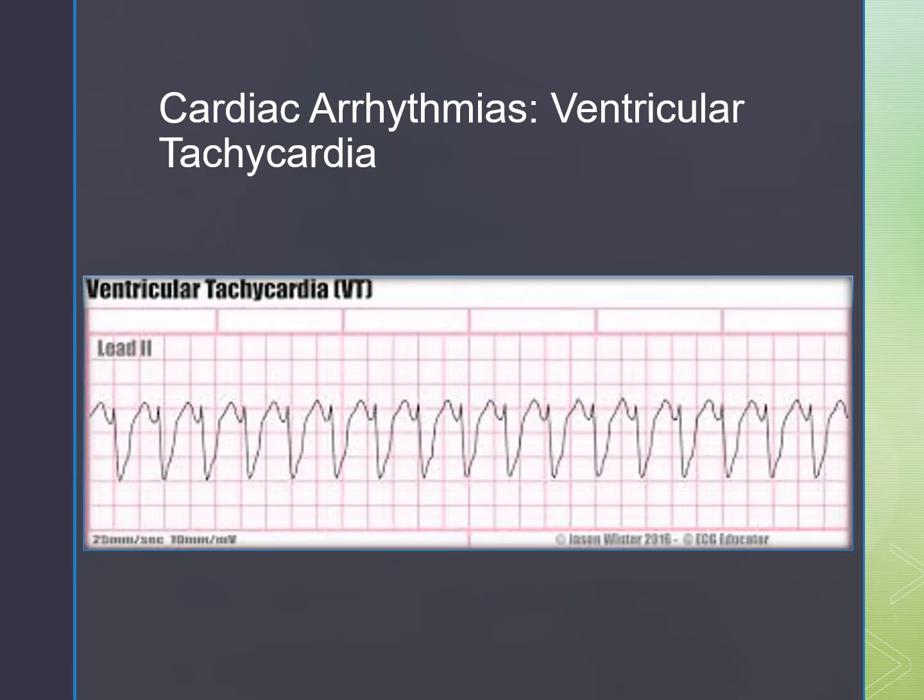This is ventricular tachycardia, where we have a single irritable focus in the ventricle that initiates and then continues the same repetitive pattern. The ventricles beat very fast, 150 to 200 beats per minute, and the cardiac output is significantly decreased. This is a fast rhythm that you need to know.